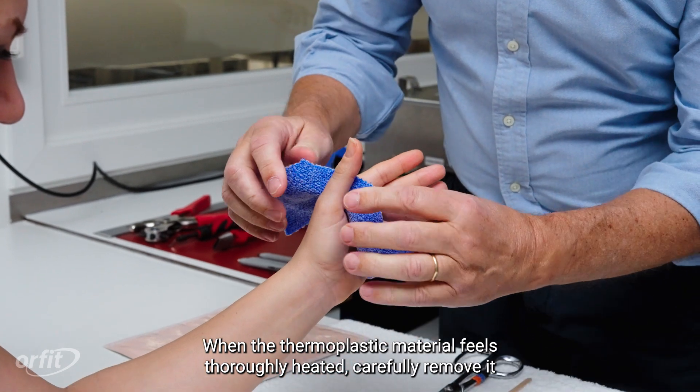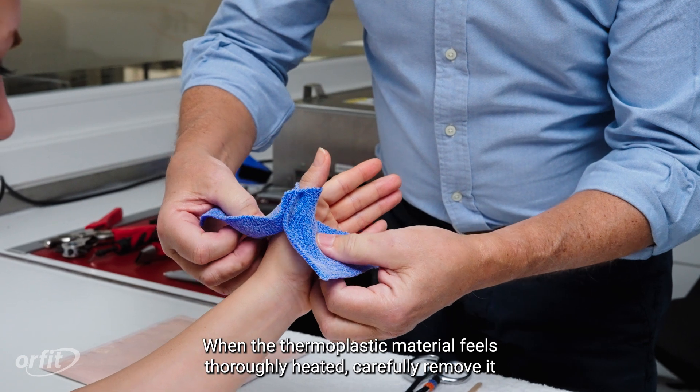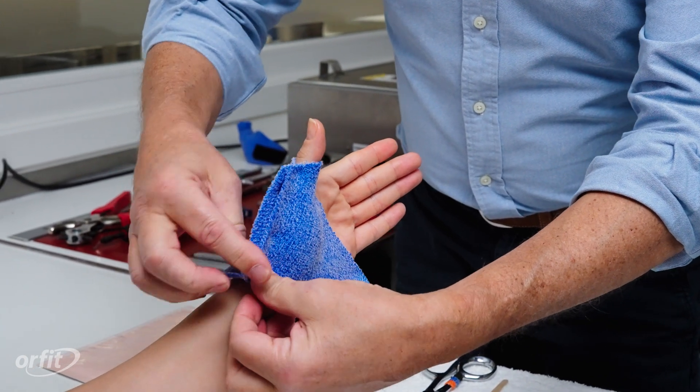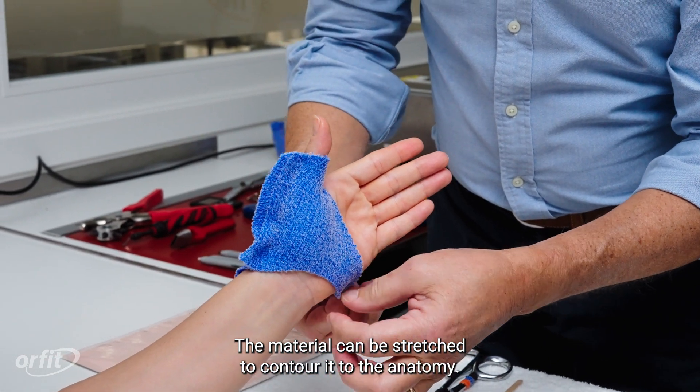When the thermoplastic material feels thoroughly heated, carefully remove it and mold it around the hand, thumb, and/or fingers. The material can be stretched to contour it to the anatomy.